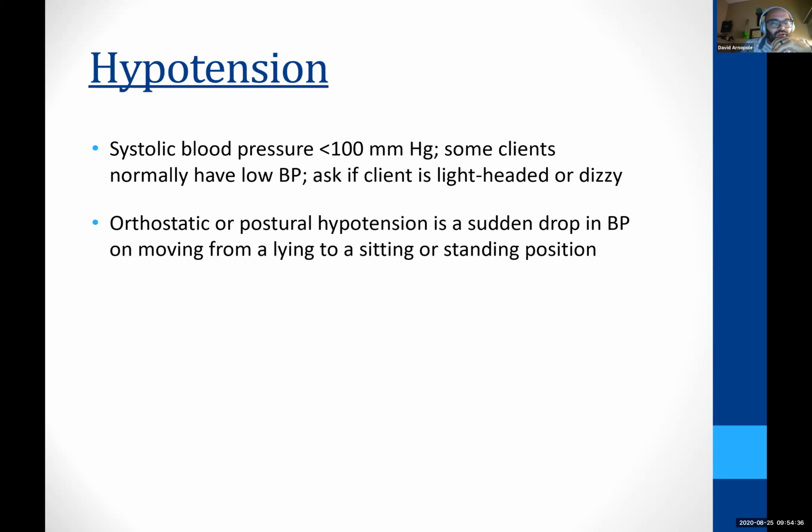The two readings from both arms, and then 6 minutes later, two arm readings again. You can just do two readings: if I just have it on one arm and then wait 6 minutes and check the arm again, that's good, because at that point I'm helping diagnose it. But if you did do two readings, where you think it's low and you check the other side, and we already have both of them low, then you can go ahead and just need one more reading to get it. But again, that's going to be based on policy, on where you're working. Just remember that when you do it, you need at least two high readings for that.